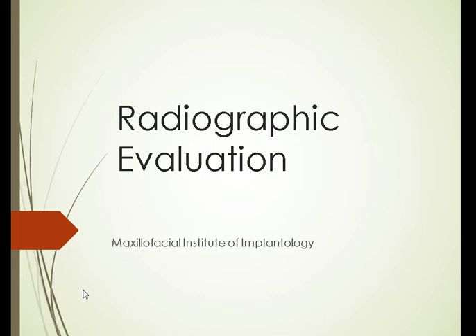And we start out with radiographic evaluation. The reason I picked up this topic first is because this is a tool we're going to use again and again when we're going to talk about anatomy, about even types of bones, and obviously during the surgical protocol lecture. So this will come again and again.